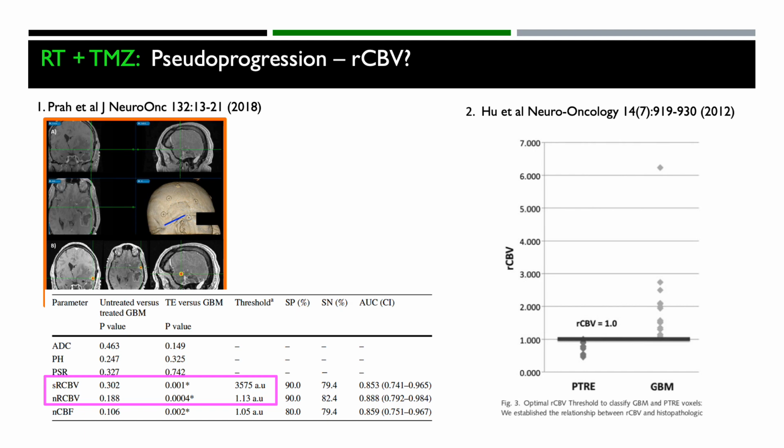And this confirmed a previous study also performed by Dr. Leland Hu at Mayo Clinic in Arizona to also show that rCBV could be used to distinguish the post-treatment radiation effect from the glioblastoma multiforme, the high-grade brain tumor.